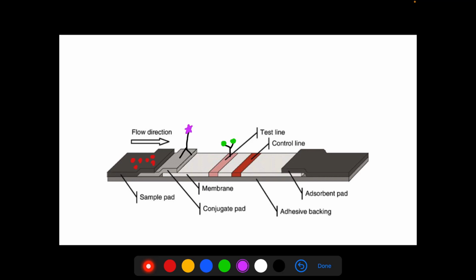So once the drug is present in the specimen, or the metabolites of the drug are above the detection limit, it will bind to the limited binding site of the labeled antibody. So once it reaches this test area, the labeled antibody will no longer be occupied by the immobilized drug. So there will be no band formation. This no band formation indicates what type of result? This is a positive result.